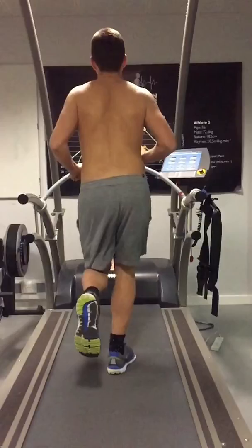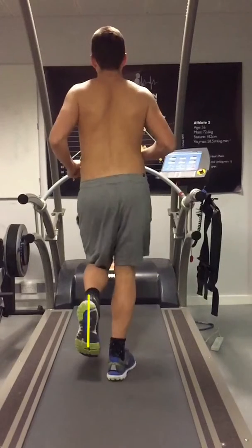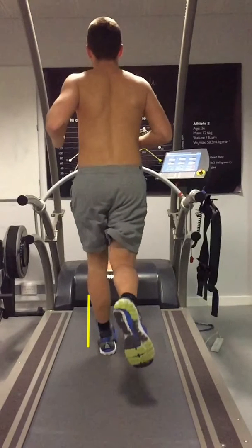If we also look at the position of his foot during takeoff, on his left hand side we have a straight position of the foot, and then if we run the video through looking at the position of his right foot, we can see that the angle has changed as his foot turns out and his lower leg externally rotates.